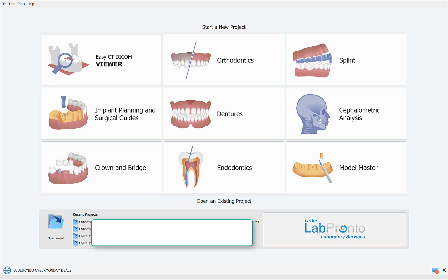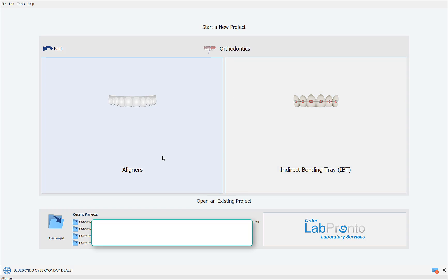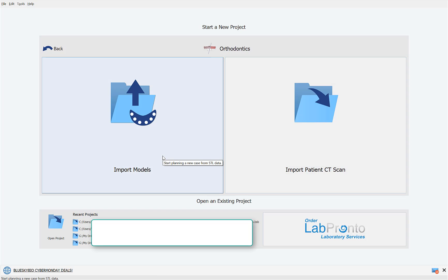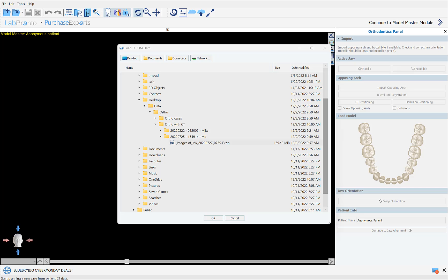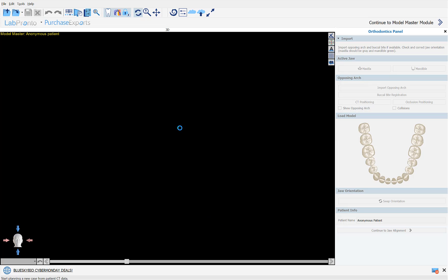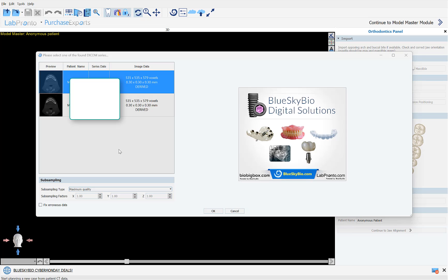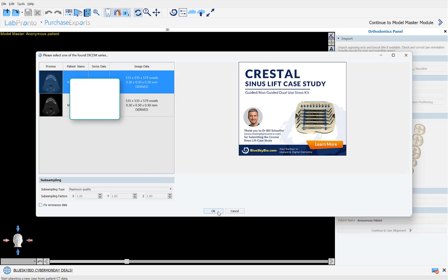Simply start by opening Blue Sky Plan, clicking on orthodontics, selecting aligners, and selecting the option to import patient CT scan. Navigate to the location of the CT scan on your computer, select the relevant scan and click OK. Select the relevant preview and click OK.